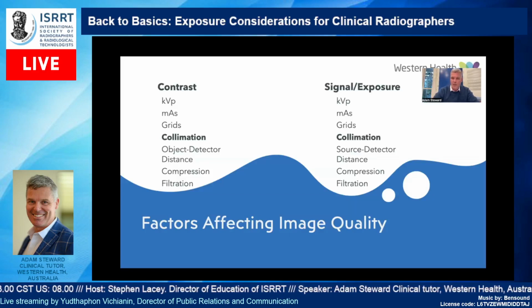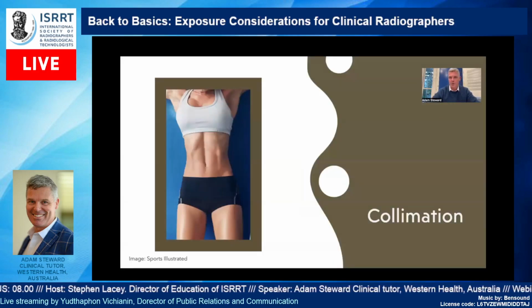Right, let's look at collimation now. And this, for me, is the real unsung hero. I'm sure there's plenty of students out there who will understand collimation. Here, old codgers like me talking about collimate, you need to collimate, because it was a really true thing in plain film days. It made a massive impact to the quality of your image, and it still does on digital systems in a big way.